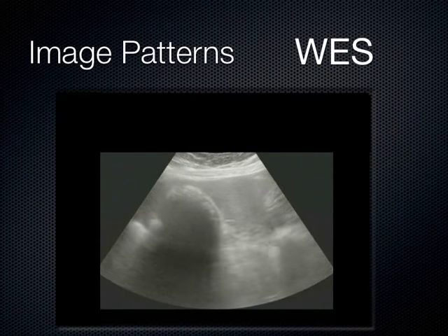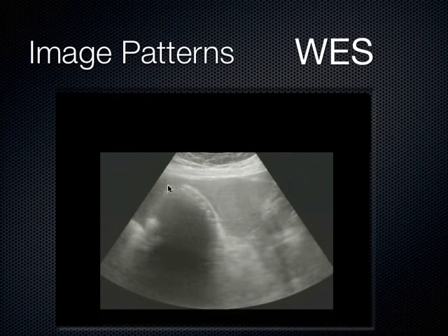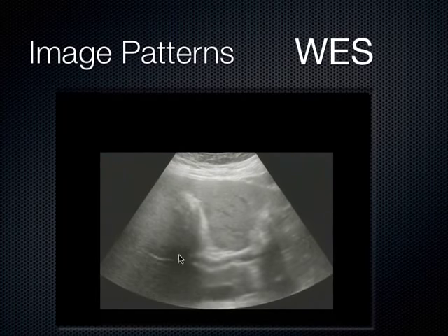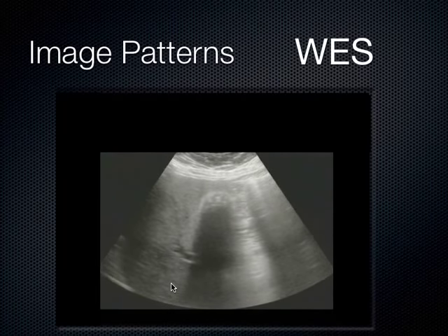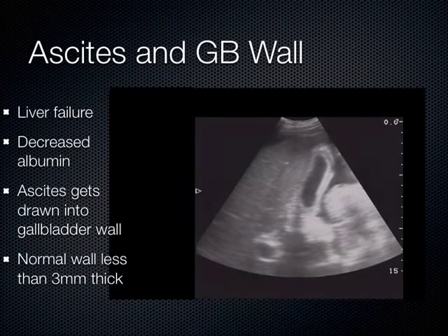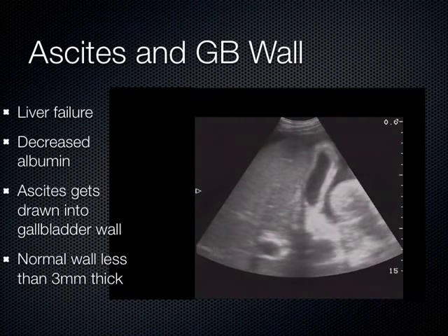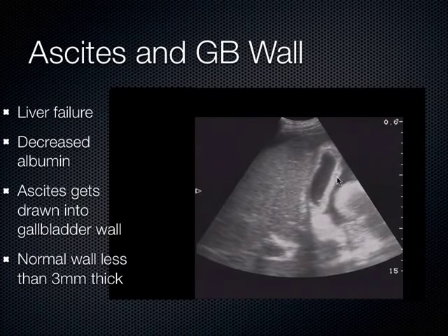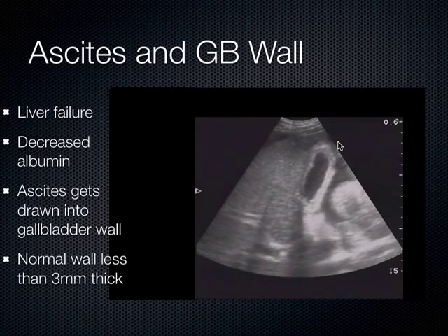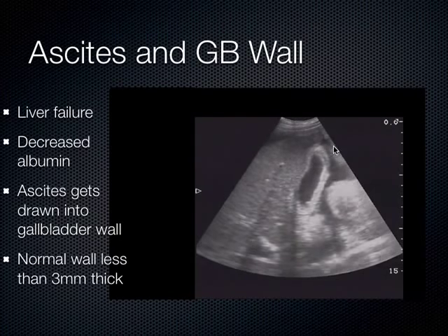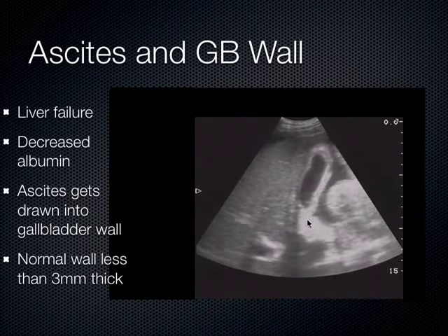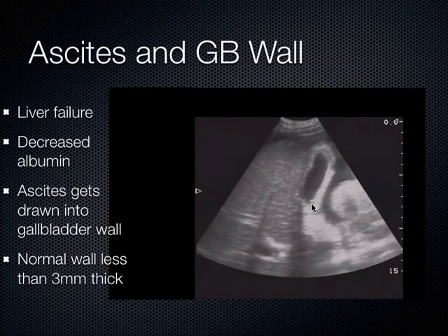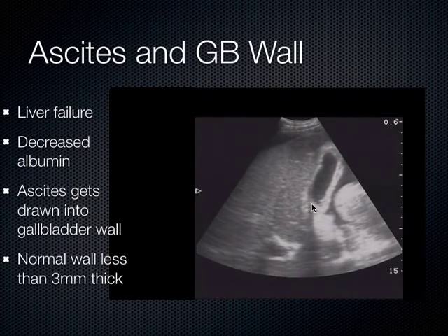This is actually a true WES sign — a contracted gallbladder around a whole bunch of stones whose collective shadows cast a big shadow out of the liver. When you have ascites — where the liver stops working and fluid third-spaces into the peritoneal cavity — it leaches into the gallbladder wall, and patients with ascites almost always have very thickened gallbladder walls. A normal gallbladder wall should be less than 3 millimeters thick.